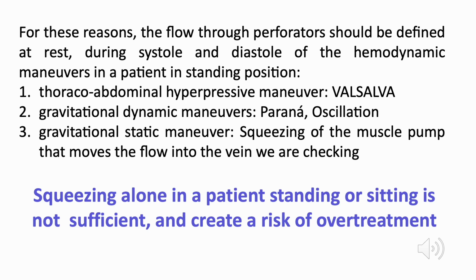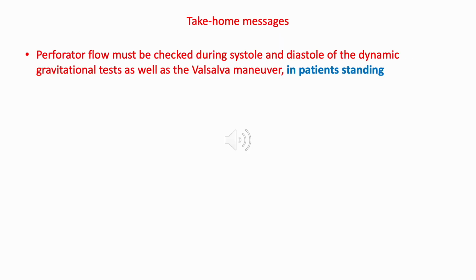For these reasons, the flow of a perforator should be defined at rest and in systole and diastole of both the Valsalva and Parana maneuver. Squeezing alone in a patient standing or sitting is not sufficient. Take-home messages. Perforator's flow must be checked at rest and also during systole and diastole of the gravitational test, as well as the Valsalva maneuver.